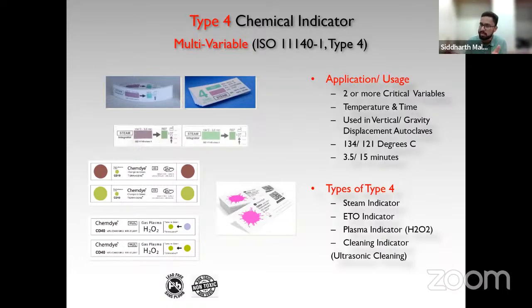That averages the cost of your total sterilization practices, and it ensures that you get good sterilization. This comes for steam also. This comes for ETO also. These are package monitoring. So that means you will have to place each and every indicator inside each and every drum or a tray which is going inside the chamber of the autoclave, right?